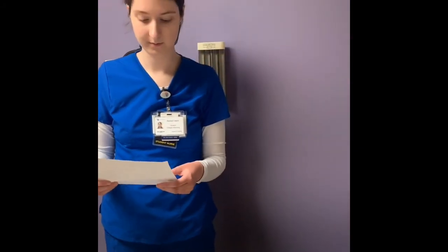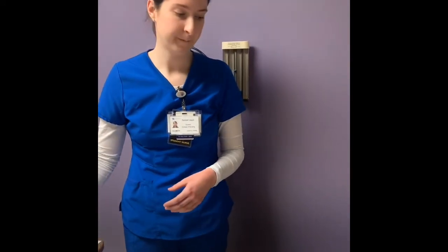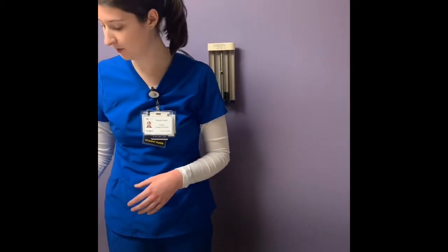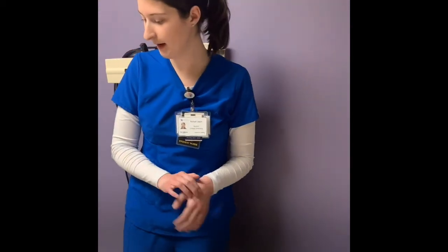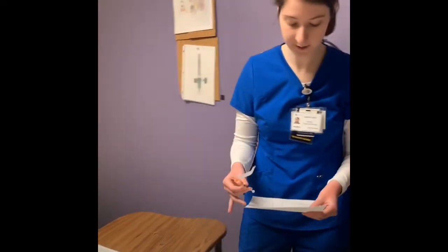I'm allergic to morphine. Okay, perfect, that is correct. That is what is written on my MAR here. And then I have a couple questions to ask you. Can you tell me where you are right now? The UK College of Nursing. Okay, and can you tell me what day of the week it is today? Monday. Perfect, okay, so that would indicate that this patient is alert and oriented. All right, so now I am safe to do my third and final med check.